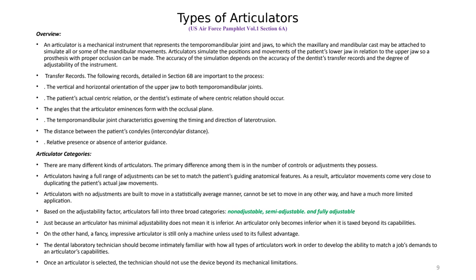A fancy adjustable articulator is still just a machine, but one with enough tools to adjust it to mimic exactly how the patient moves their jaw. Dental laboratory technicians should become intimately familiar with all types of articulators to match the job's demand to the articulator's capabilities. Plan what kind of articulator you will use before starting a case. For a simple single filling, a non-adjustable hinge articulator is fine. For a full mouth rehabilitation, you need a semi-adjustable or fully adjustable articulator.